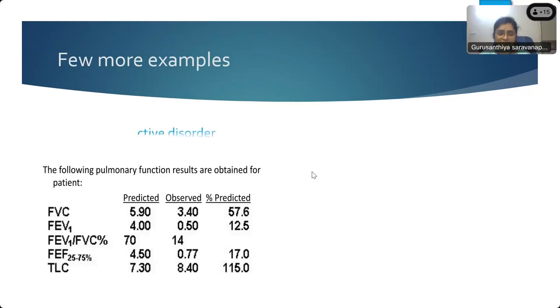Okay, so this is an obstructive disorder. It's a severe obstructive disorder.